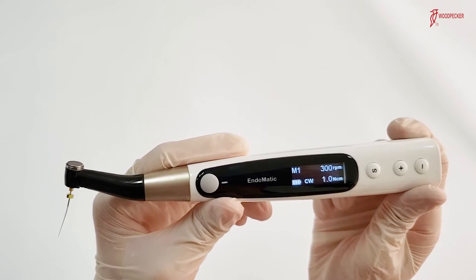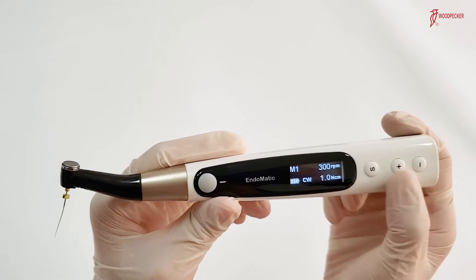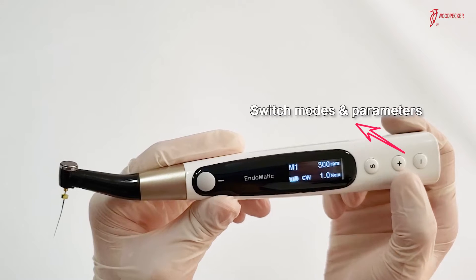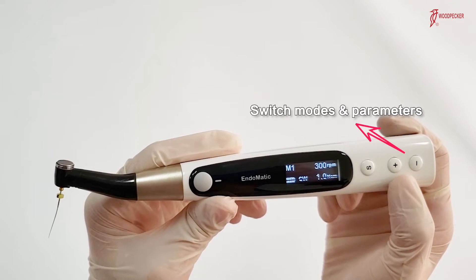We select different functions and parameters through these 3 buttons. Press the S button to select different functions, and press the plus and minus buttons to switch between different modes and parameters.